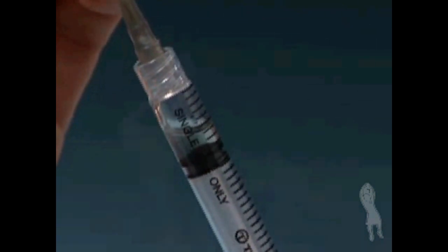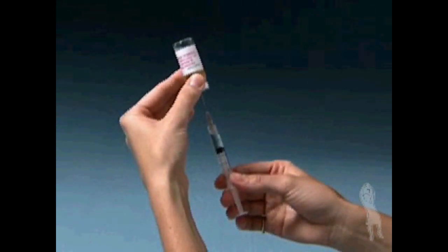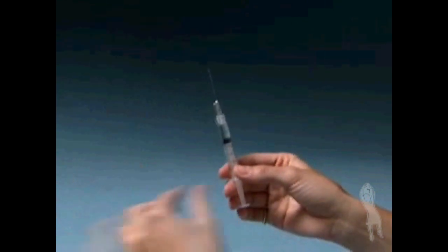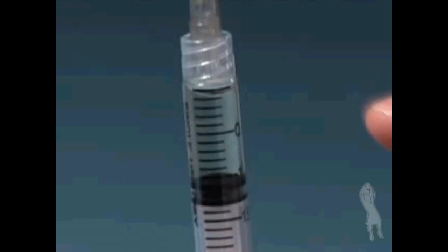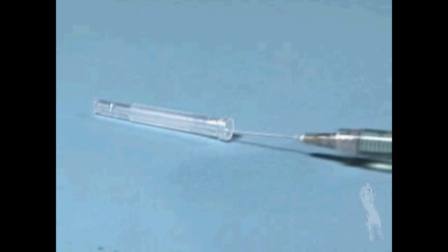By slowly backing the needle out of the vial as you withdraw the solution, you will only be using a portion of the medication for each injection, not the entire vial. Remove the needle and syringe from the vial. To remove any air bubbles, point the needle upward and gently tap on the syringe. When all bubbles have risen to the top, slightly press the plunger until a small drop of solution appears at the tip of the needle.